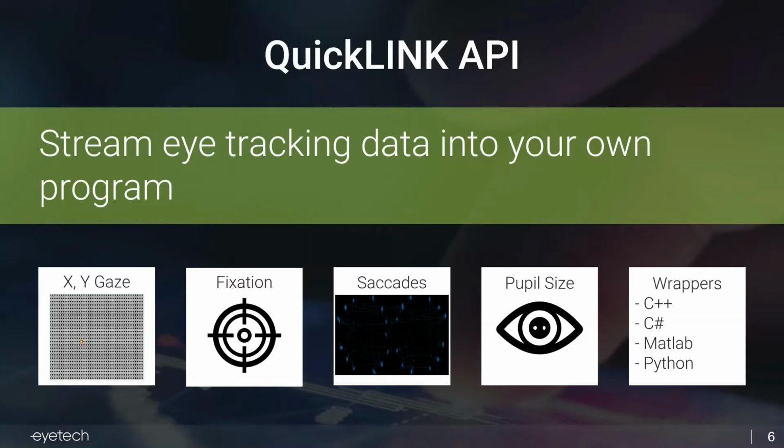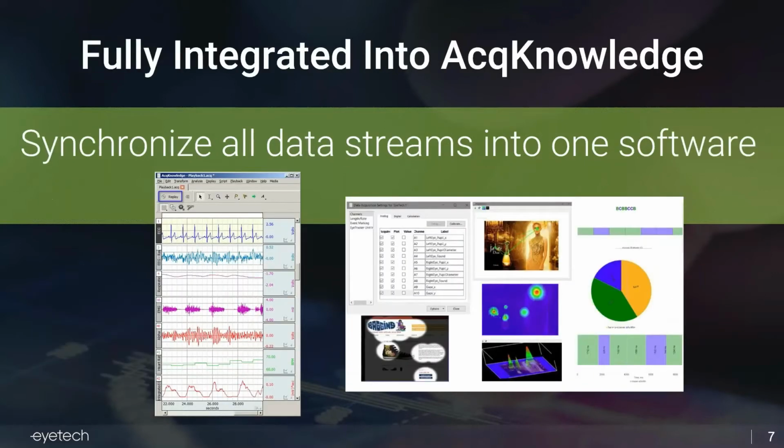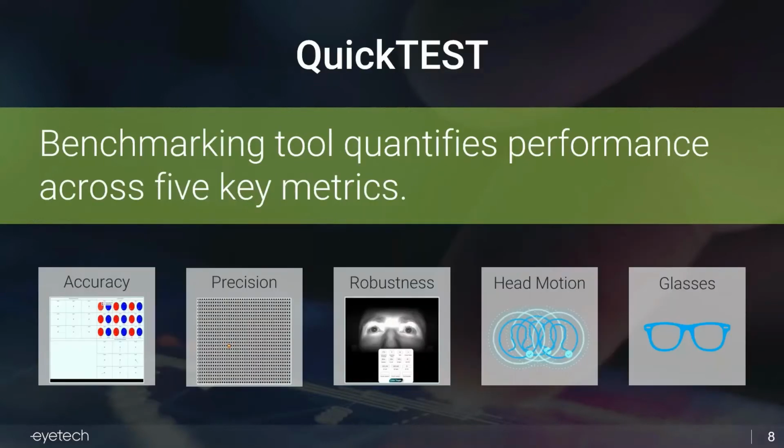We do have full integration with AcqKnowledge, thanks to Frazer and his dedicated team, so you can synchronize all the data streams into one software, which will greatly reduce the amount of time it takes to do your research with ECG, EKG, EMG, and eye tracking and other physiological sensors.